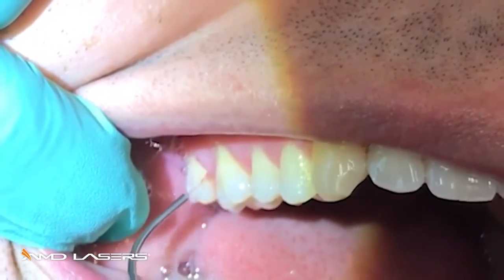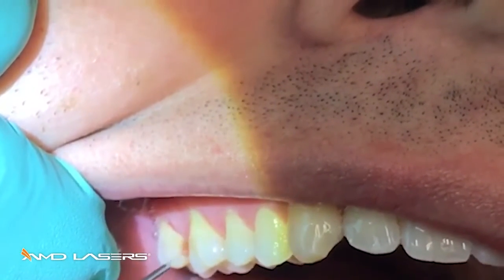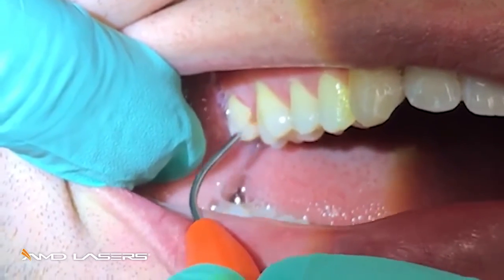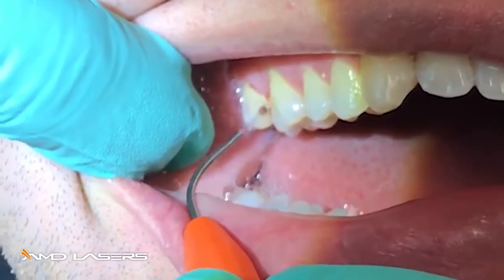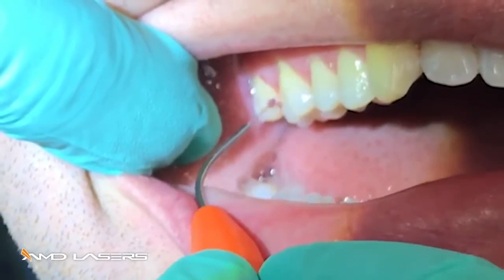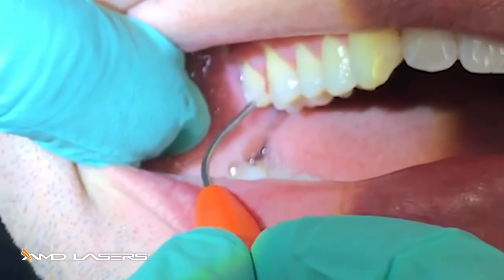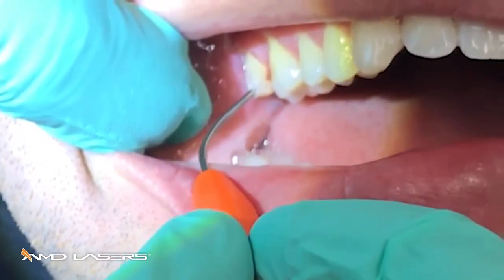Do both sides of the papilla, gently sweeping against the tissue. All that necrotic tissue — gone. The patient is feeling very comfortable. If you give the tissue a little rest, the energy is going to the dark inflamed necrotic tissue because the laser energy is not attracted to the pink, firm, healthy tissue. Remember, your diode energy is attracted mainly to melanin and hemoglobin.